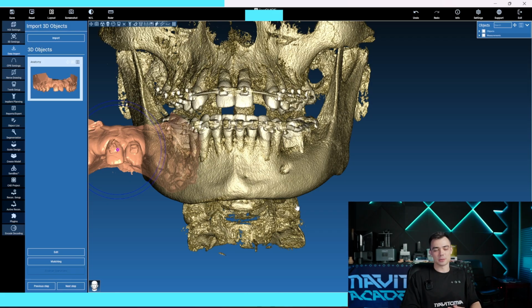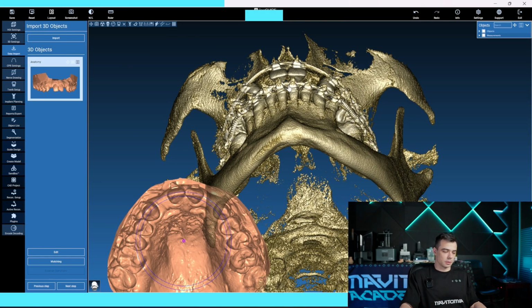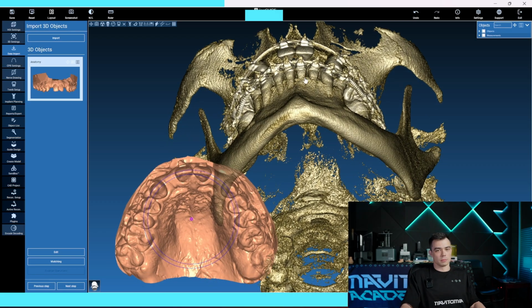It's not a really good idea to plan your surgery before braces and before orthodontic activity, because it's extremely complicated to calculate the teeth movement during the orthodontic treatment, and it's much safer and much more logical to plan your implantation, to plan your surgery after braces have been done, or in the final steps of your orthodontic treatment. I think it's clear, and that's almost obvious for every doctor, depending on being a surgeon or prosthodontist or orthodontist, never mind. What's next?